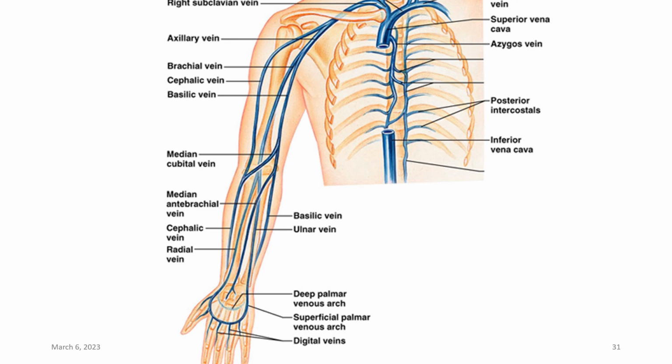So that really leaves us just with our basilic vein. We knew that our basilic vein is a superficial vein. It runs up the medial side of the arm. When it combines with the deep brachial vein, it's going to form the axillary vein. So we're looking at this last superficial vein where we know we're at higher risk for having thrombosis.